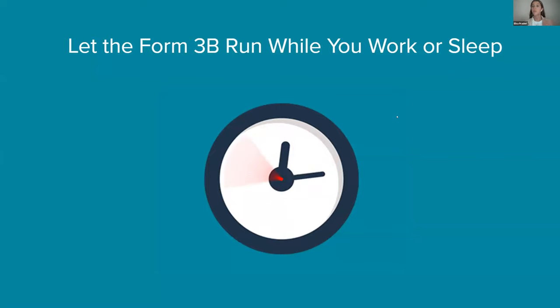So if you need to print models for that day, or you have a patient that has an emergency and lost their retainer or broke their aligner, then you can use horizontal printing directly on the build platform. And maybe you can print a model with draft, for example, for very fast model production in approximately 20 minutes. But if you finish your practice for the day and it doesn't matter if you need a model for that exact same day, then you can plan to have your models printed vertically so you can combine more models in one print job and let it print overnight. So it's a matter of understanding how you want to structure your practice overall, and you can choose between these printing parameters in order to optimize your time.